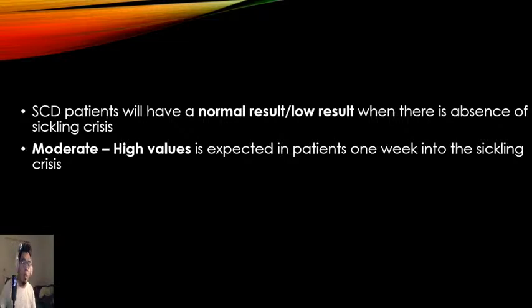We would run it, and we don't need to do anything else if it's within the normal or lower range. But yesterday, the kid was sent to the emergency room, and one of the tests the doctors requested was ESR, and we believe she's been having a sickling crisis for almost a week.